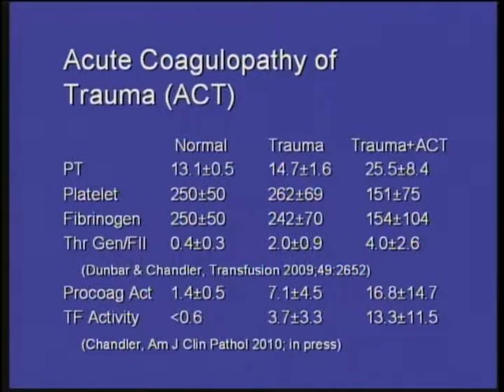Now, the other things that we looked at were sort of an assay for overall procoagulant activity. In other words, anything that would initiate the system and how much tissue factor activity they had.